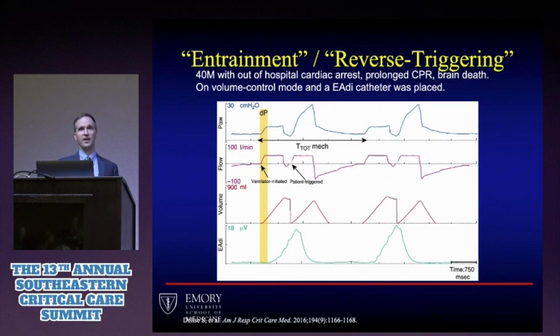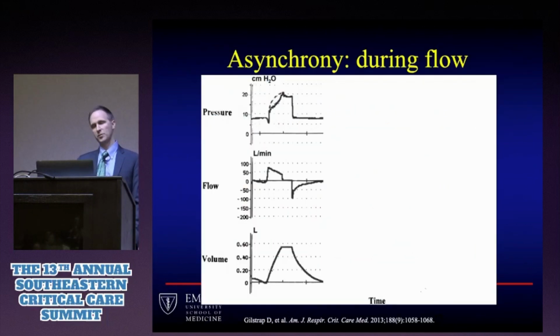They put a diaphragm transducer on the patient after the patient was declared brain dead as part of a clinical study. And he was having strong diaphragm effort with essentially this entrainment phenomenon. After the breath had been given, then the diaphragm starts taking the breath. It's considered almost like a reflex in a sense. So sometimes when you see this, you don't need to sedate it, because the patient's sedated already.